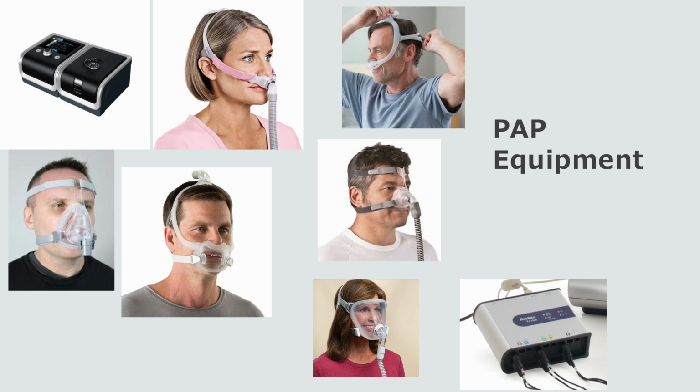Here's a good example of CPAP equipment that you'll find in the lab. This is the TX Link, and it's the adapter box that allows the computer to talk to the CPAP. These are incredibly hard to find right now. Sleep things are a little scarce to purchase for labs, and it's been that way since COVID. With the TX Link application on your computer, you can change all the settings on the CPAP from your computer, so you don't have to go into the room every time the pressure needs to be changed or you want to do EPR or something like that.